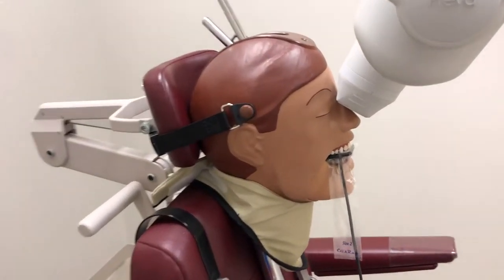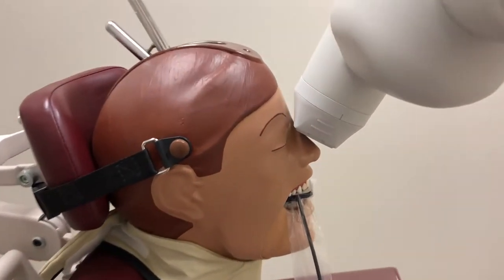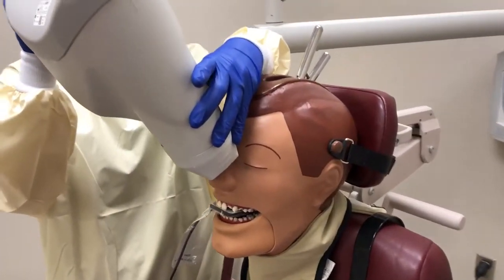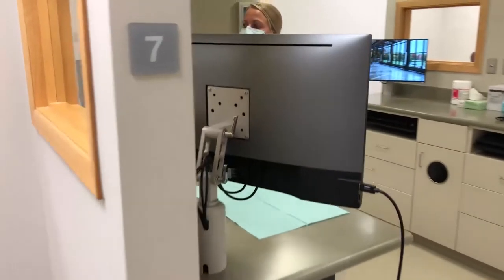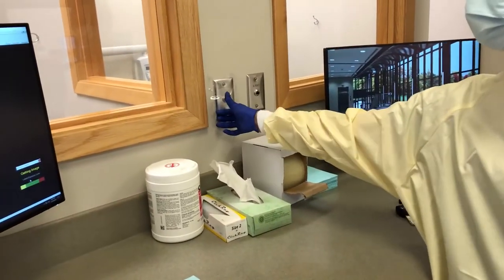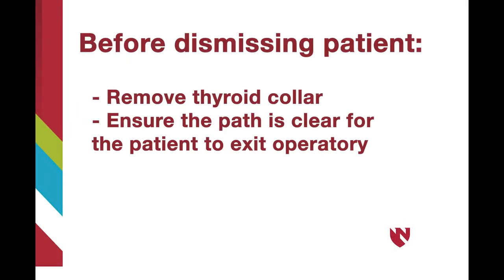Next, place the position-indicating device at a 60-degree vertical angulation with the central ray directed through the midline of the arch toward the center of the sensor. The top edge of the position-indicating device should be between the child's eyebrows on the bridge of the nose. Now instruct the child patient to hold still. Step out of the room and press the exposure button. Remember to hold the button for the full duration of the exposure. Once complete, walk back into the room and remove the sensor and the thyroid collar from the child.